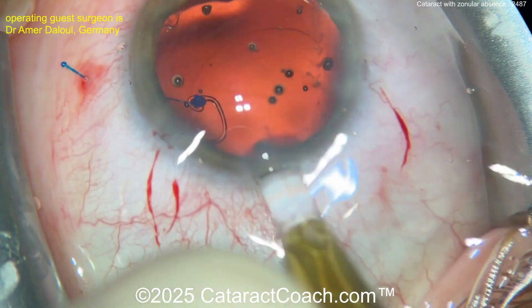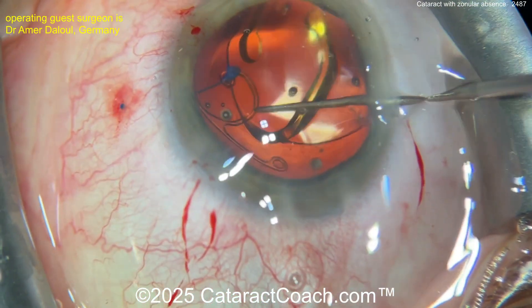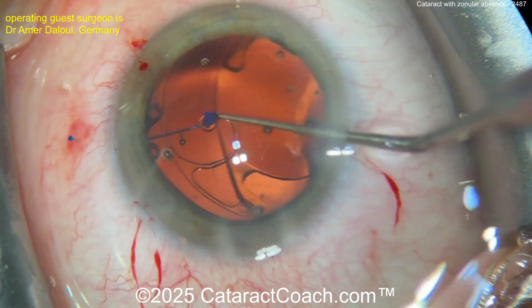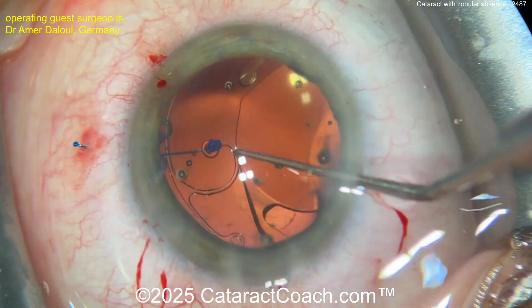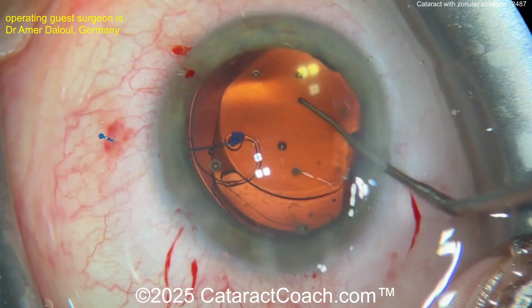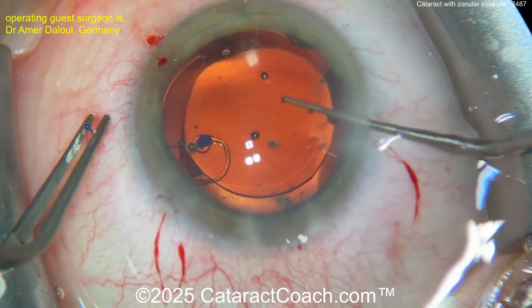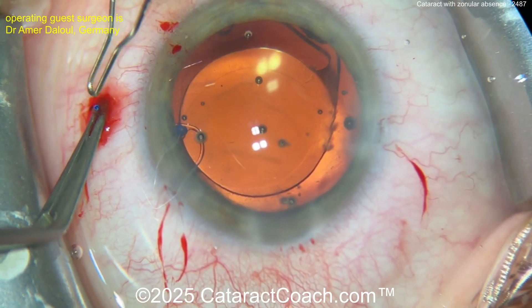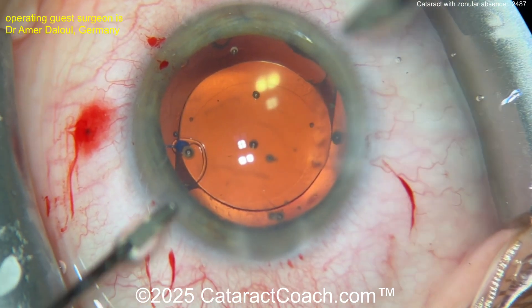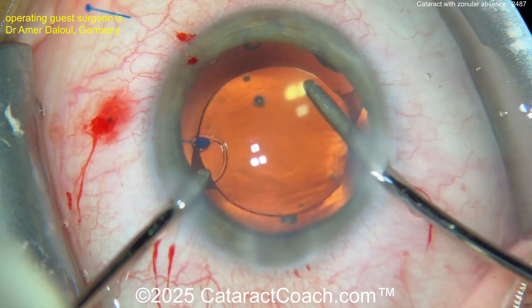That nice flange has been created — tighten that up a little bit. Look how decent the rhexis is. That suture is a little too loose for the support; get the lens in the capsular bag — that looks good. Make sure it's completely within the capsular bag. Now tighten up that prolene suture — the polypropylene — there you go, now it looks a lot better. You've got to tighten that up, so reflange it, cut that end off, reflange it. Remember, you're also going to bury that flange within the sclera — don't leave the flange just sitting under the conjunctiva because over time it could erode right through.